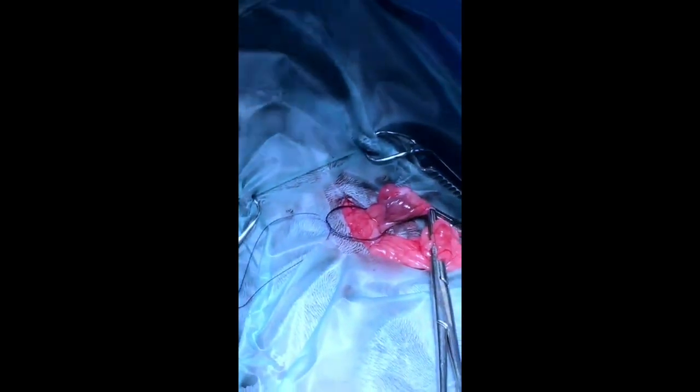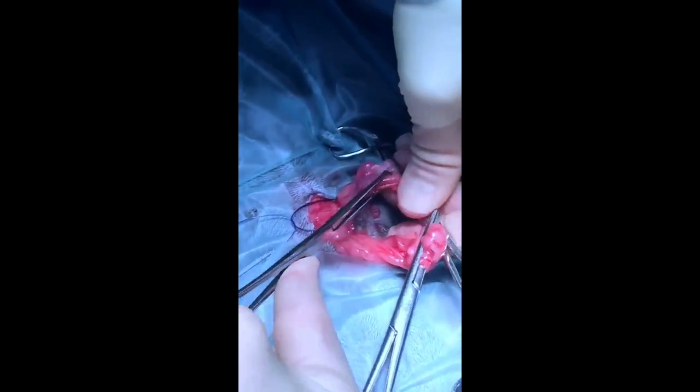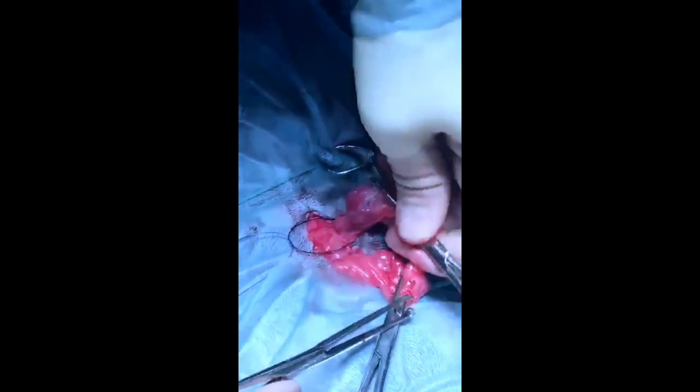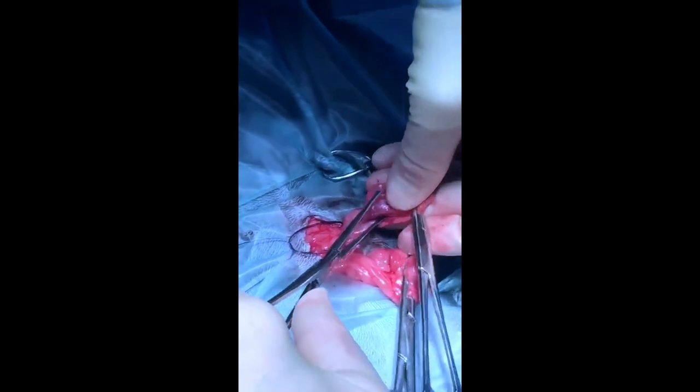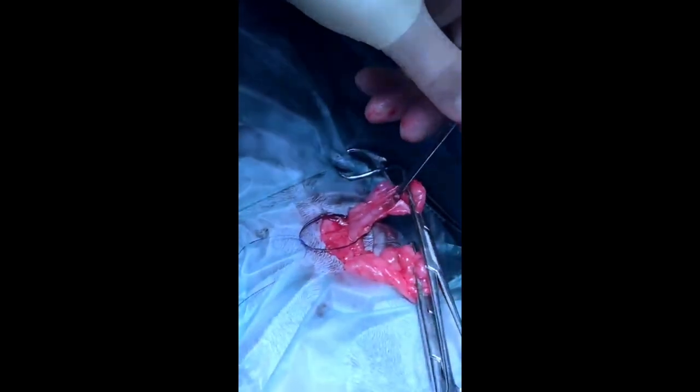I'll slide the knot over the ovary and park it over the pedicle for a short while whilst we apply a pair of Allis tissue forceps. We use these because it avoids any traction on that back edge of the pedicle and applies more axial traction. Once placed, pass the forceps to an ungloved assistant who uses their little finger to apply a little bit of tension to the forceps.